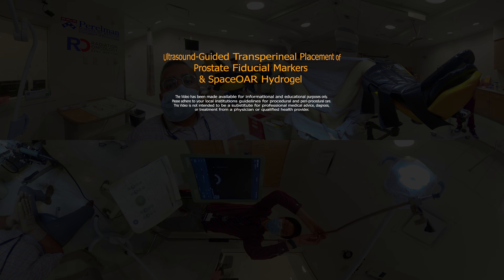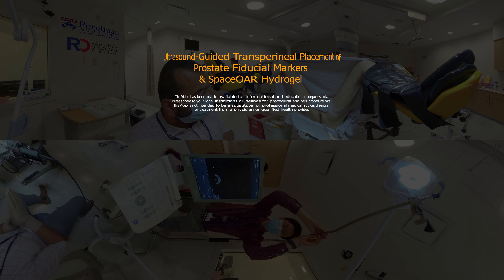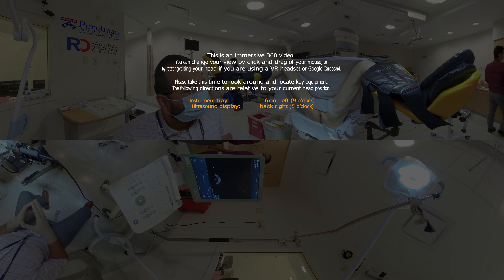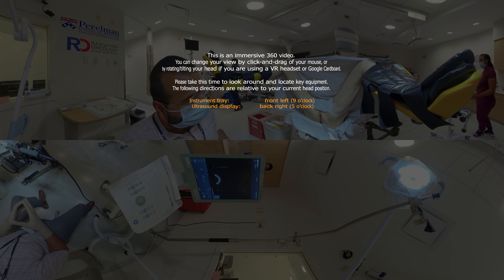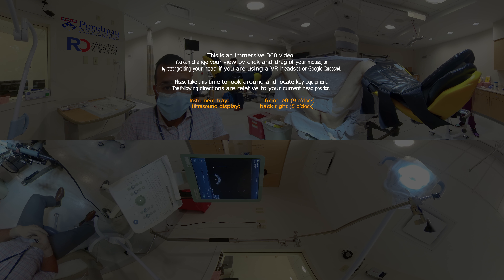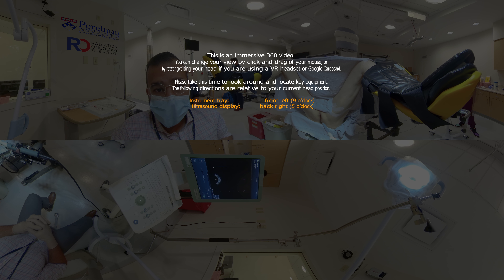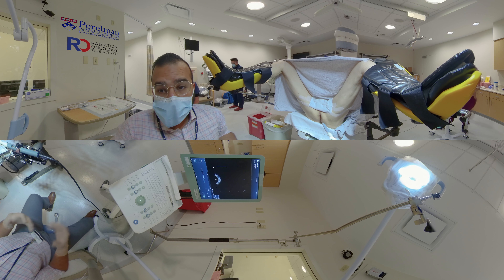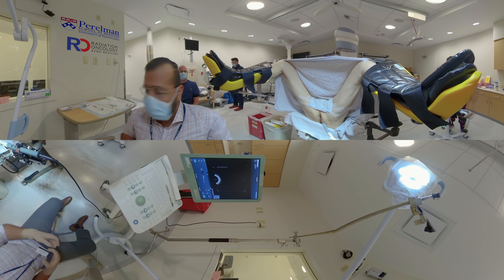Hello, my name is Dr. Neil Tonk. I'm an assistant professor of radiation oncology at the Perelman School of Medicine at the University of Pennsylvania. What we'll be doing today is transperineal placement of prostate fiducial markers, as well as implantation of a rectal SpaceOAR hydrogel for intact prostate radiotherapy. We will walk you through the procedure from start to finish.